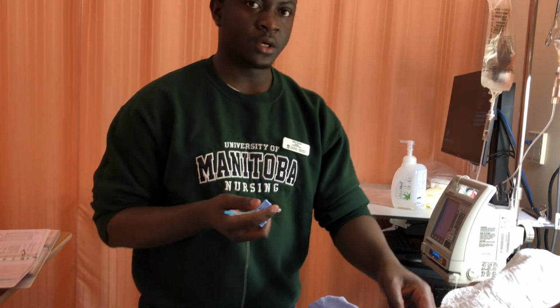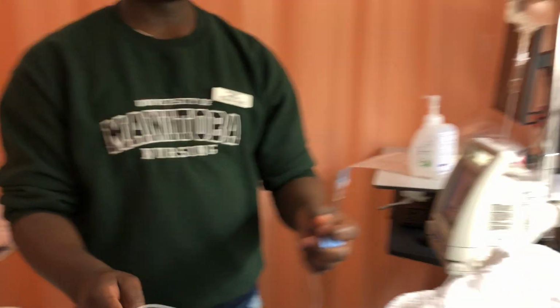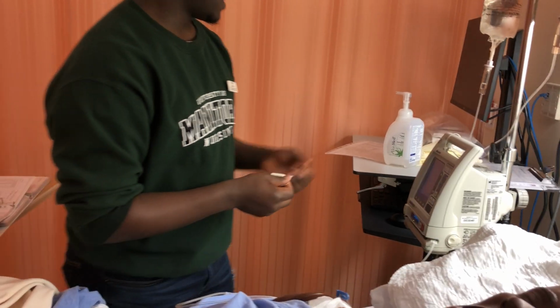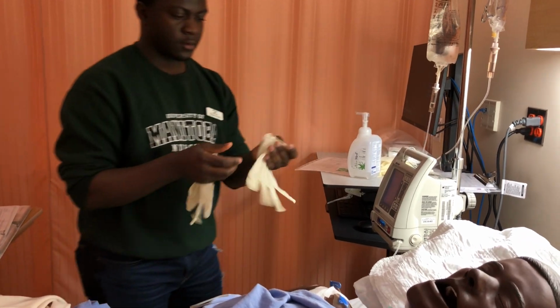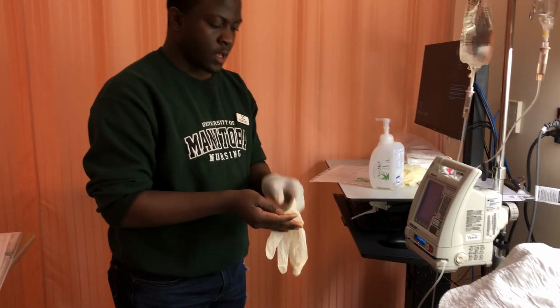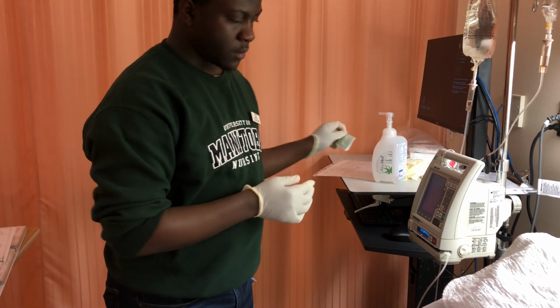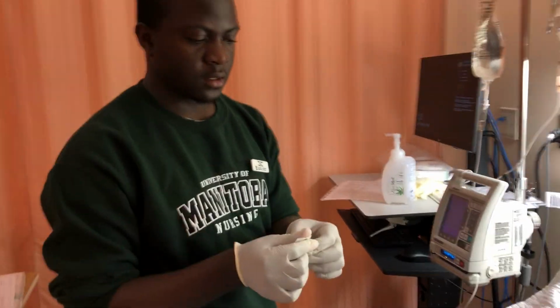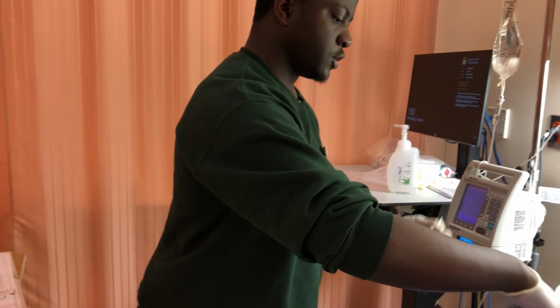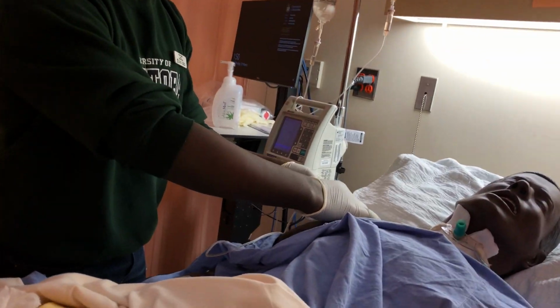And then at this point I can infuse my heparin, and I'll be doing it in the subclavian vein. At this point I noticed that I did not bring an alcohol swab to the room, so I can just call the second nurse to grab me one, and I have an alcohol swab here. Just because I'm accessing a blood site, I can put on my gloves here, and I will clean my port and start my heparin. I will also need a flush for this, and I can ask a nurse to grab a flush for me, just to see if my site is patent.